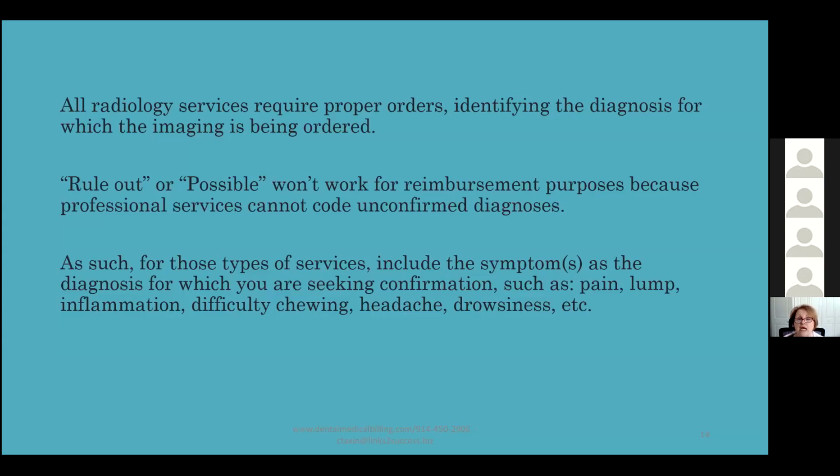So all radiology services require proper orders. So whether you're taking it for your patient in the office or not, you must document this prescription. So I'm going to recommend that you actually have a prescription that can go right into your patient's document center.